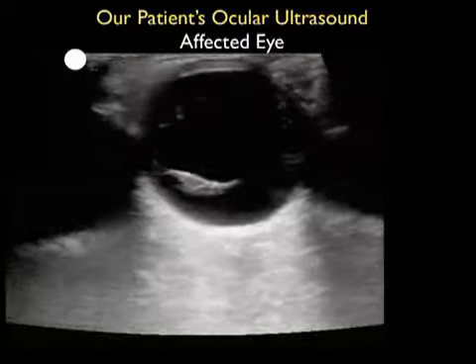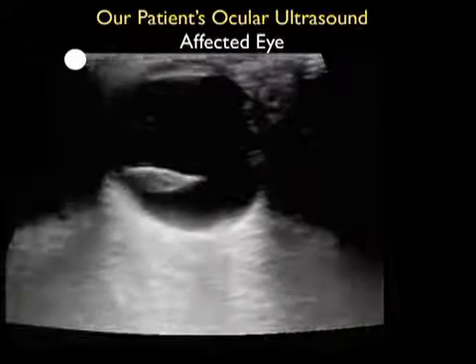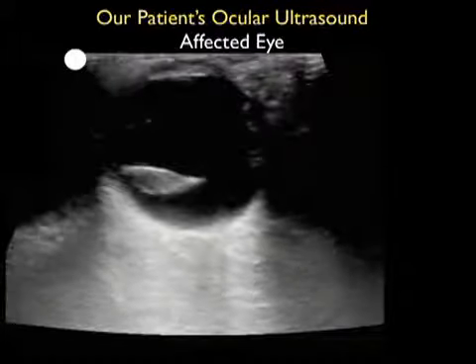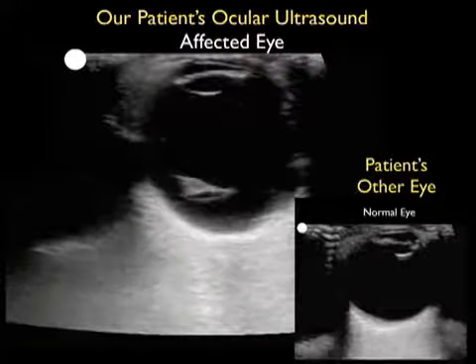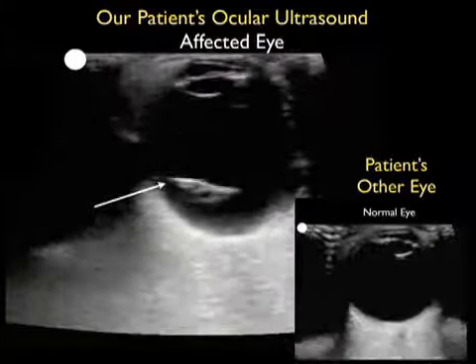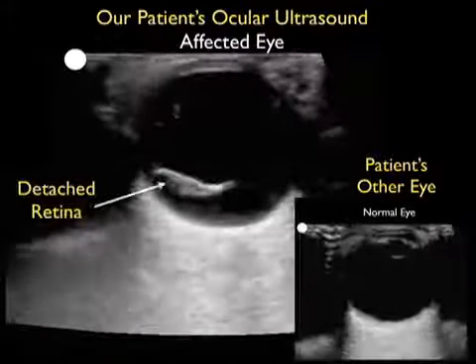Now let's return to our patient's ocular ultrasound, placing the probe in a side-to-side or transverse orientation over the affected eye. Right away we note that there's pathology within the posterior aspect of the eye, and we can see a hyperechoic or bright structure waving around in the posterior aspect of the eye that should not be there. We'll look at the patient's other eye in the small video to the right, and we note here the normal appearance of the retina tacked down to the choroid.